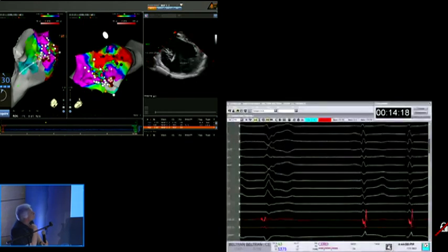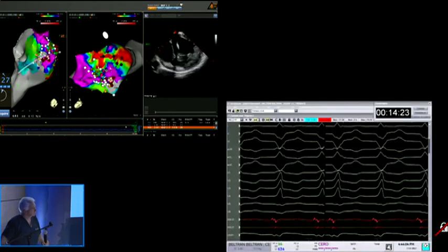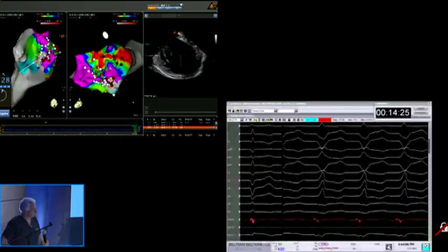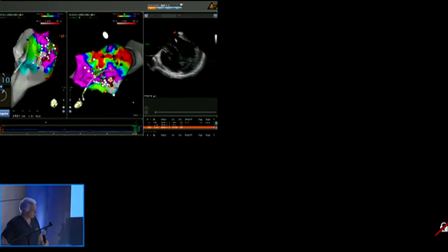This is like lava. What's the amplitude here? 0.4, but it looks like lava. And the wall is very thin. What happened with the pentarray?